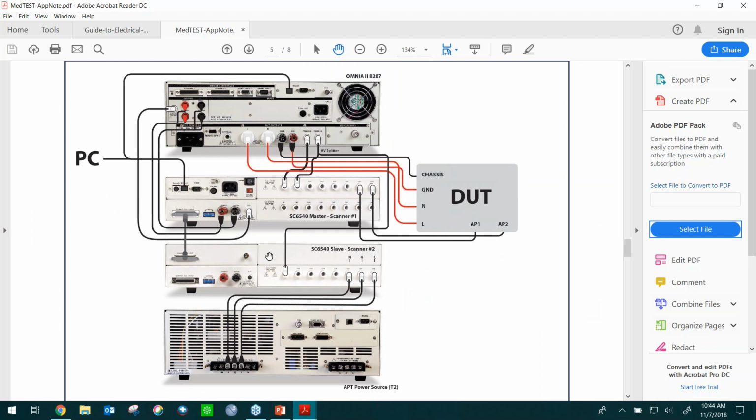Again, we're using the internal power supply to power up your product. Internally, we're going to open up the ground and measure any resulting leakage flowing from line side through the insulation of the product. Again, let me bring out the spotlight here. Any normal current will flow from line back down to neutral. This will turn on your device or run your device normally. And then any leakage current that happens towards the applied part, any leakage current that happens towards the chassis or the ground, flowing through the insulation of your product, is going to be caught by the measuring device that's inside the unit, according to the standard.